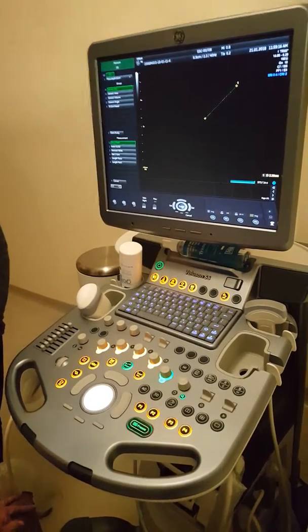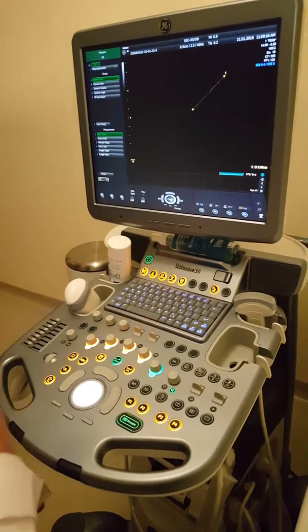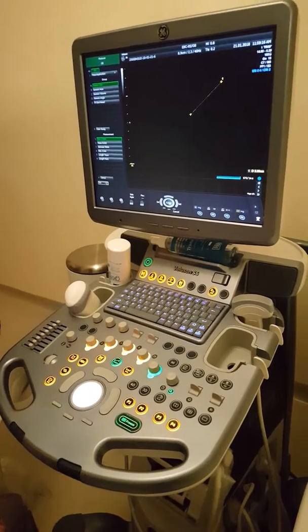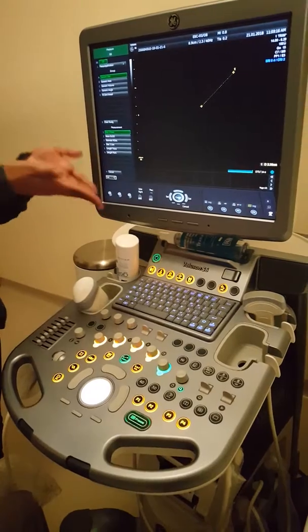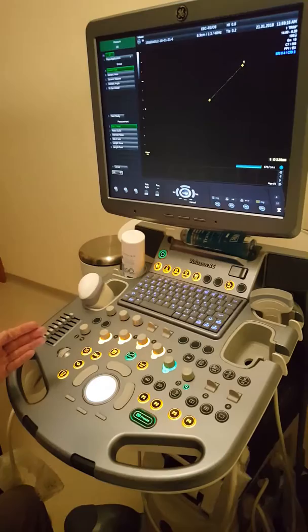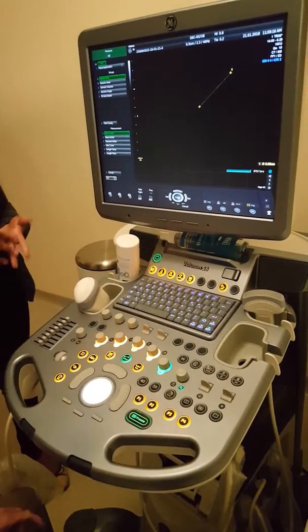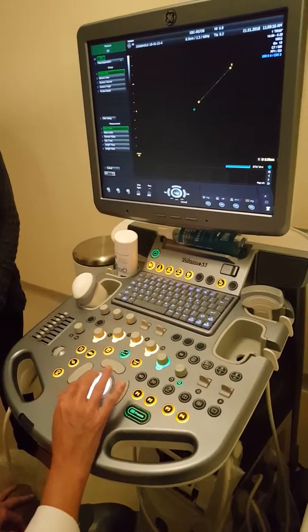Okay, you can do that. Freeze, caliper. But obviously I'm now still in the obstetrics. It won't make any difference. It will come in the report. I know what you mean. Instead of going back to gynae, another program, and doing all that, you can do it right here. But then this is an early pregnancy, and then it's not important to do your cervix. It is more the 24, 28, 30 weeks. So if you do it in this or you do it in that, it's the same thing. Doesn't matter. Okay, I understand.